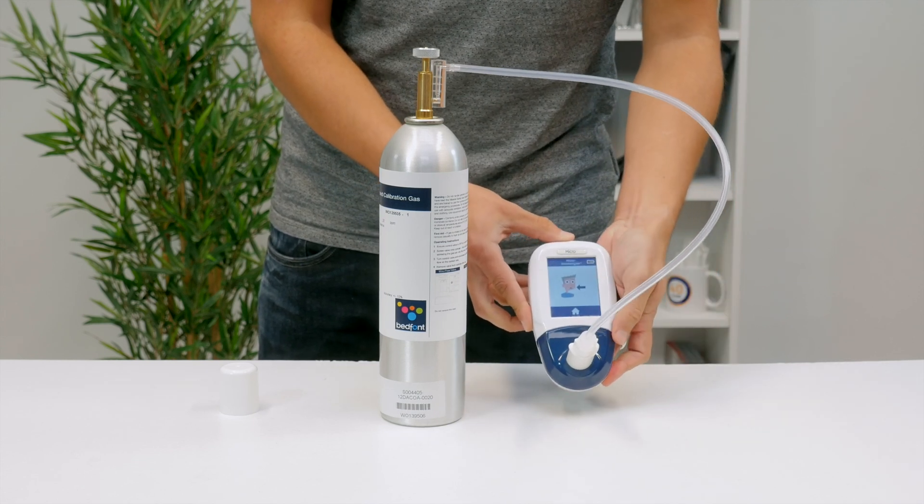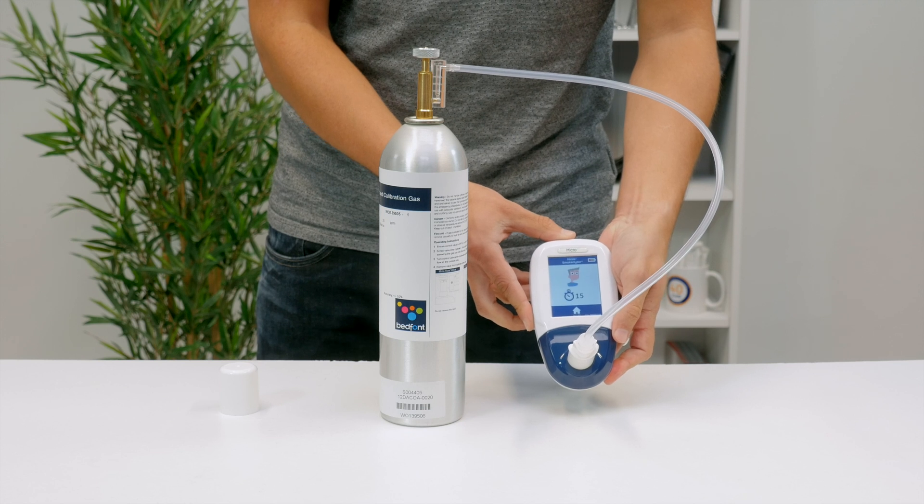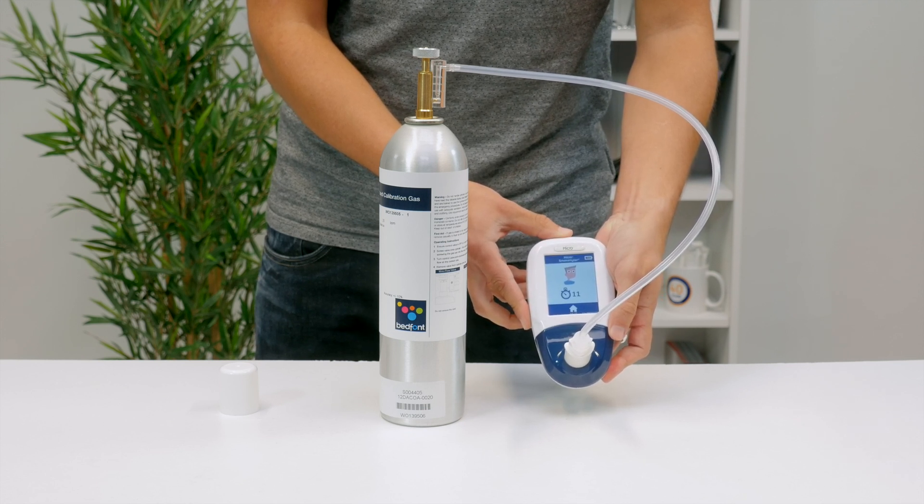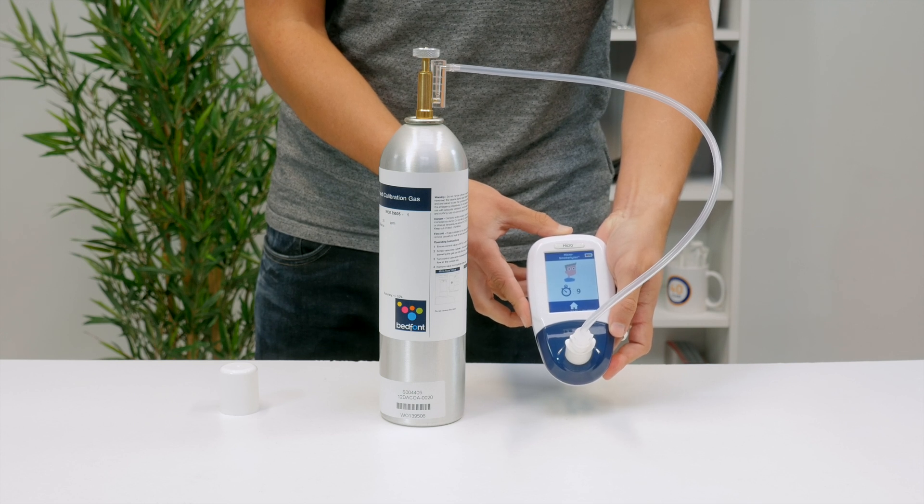On your Micro, press the breath test symbol on screen. When prompted by the exhale symbol, open the regulator and allow the gas to flow at 1 litre per minute.